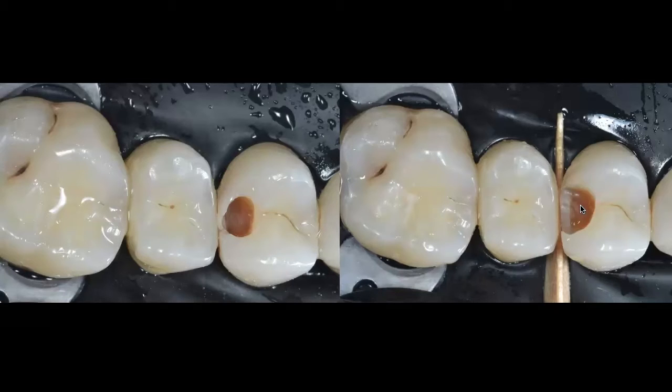So by creating that additional space, I'm going to be able to push that 245 to make that proximal wall extremely thin, and now I can fracture it either with a curette or a hatchet, just making it very, very thin so that it's easy for me to remove. Sometimes it actually just flies out of the mouth when you're using that 245 burr because it just becomes very, very thin. And this is the first step, the most important aspect of protecting that neighboring tooth. You can see that I've been able to keep that nice proximal contour on that second premolar because it was not touched by the burr.